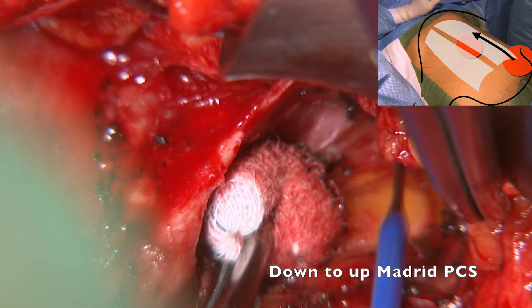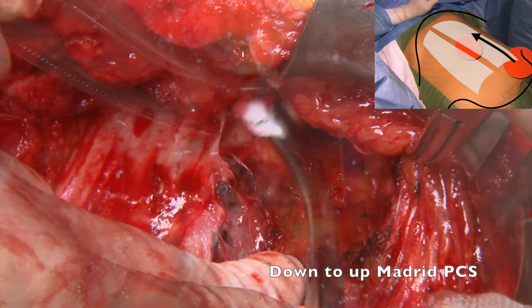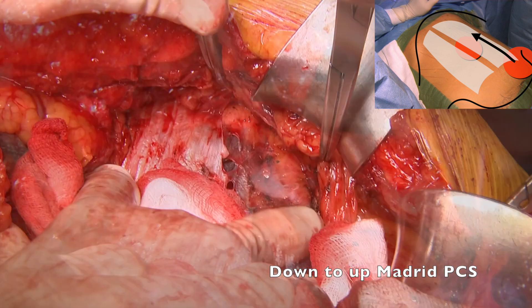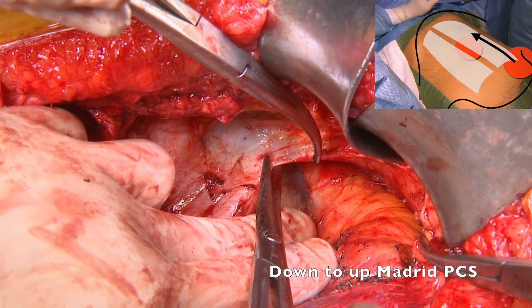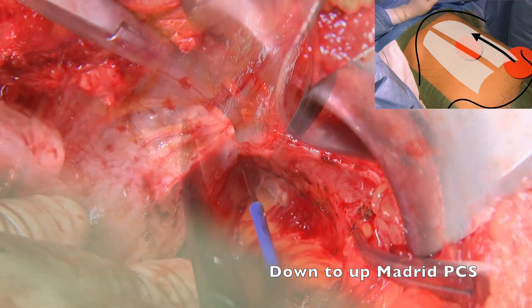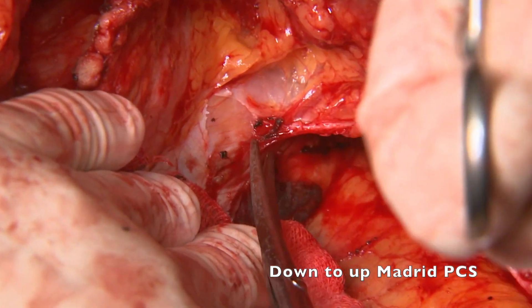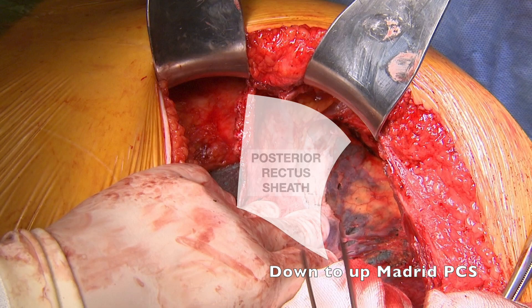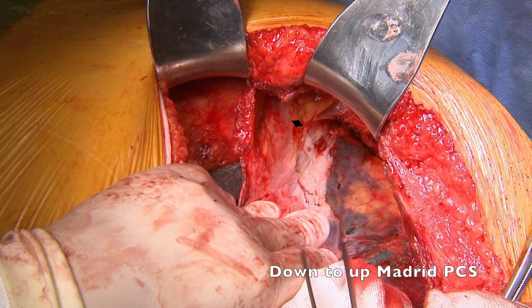Always bearing in mind that the sac is just inferior and lateral to this dissection. We preferred to perform the posterior component separation before going into the lateral defect, as the opening of the peritoneum could make it very difficult to perform our lateral release on the posterior rectus sheath. As soon as possible, we dissect laterally pre-peritoneal under the transversus abdominis to release tension on the peritoneum. We continued upwards to meet our medial incision on the peritoneum at the upper third, joining our pre-transversus dissection superiorly with the pre-peritoneal dissection inferiorly.